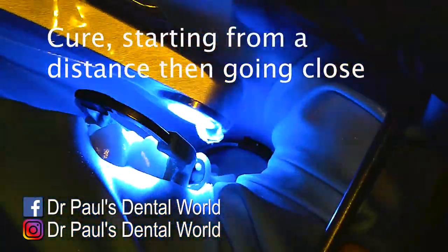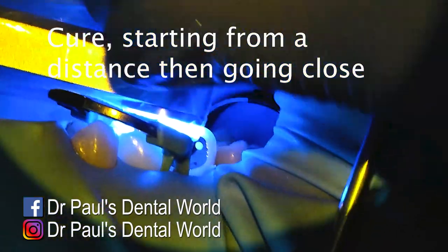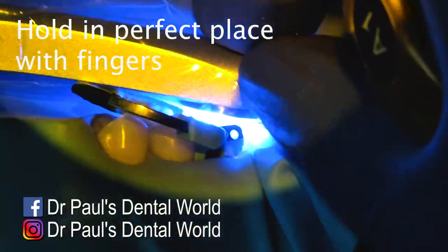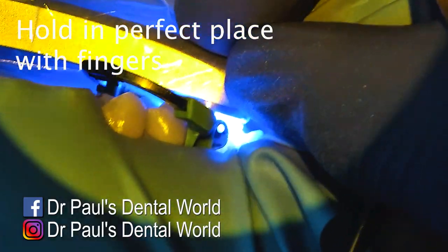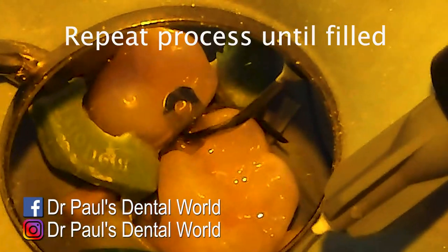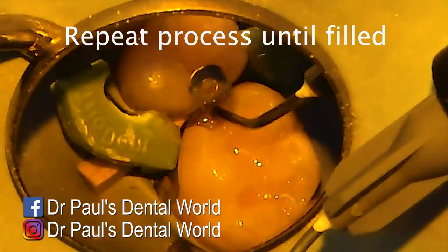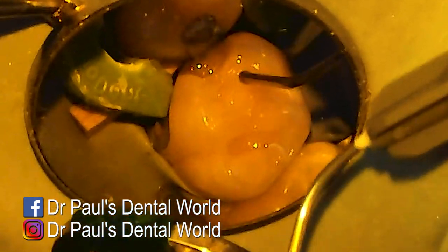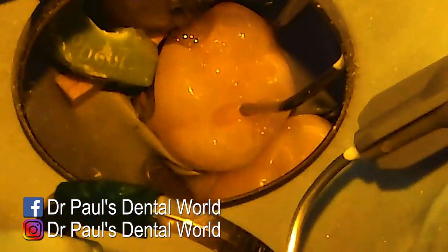After that we're going to cure it. When I cure it, I start from a distance and then start moving towards the tooth over about two or three seconds, then hold it in place. My assistant's holding one end and I'm holding it with my finger on the other to make sure it's in the exact correct position. Then same story, we're going to add another increment on the opposite side of where we placed the first one.